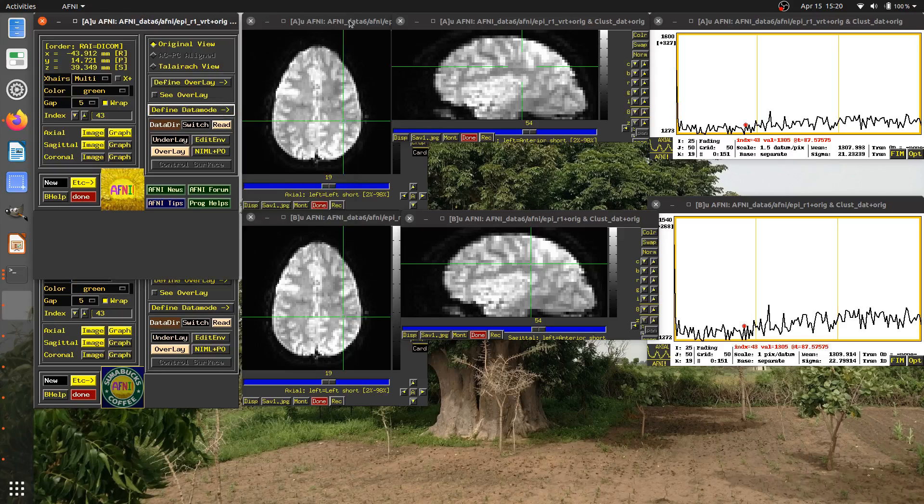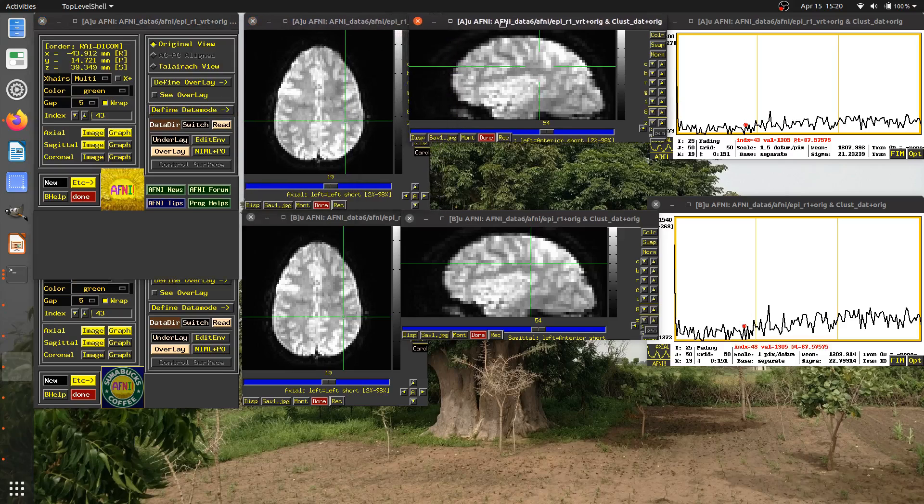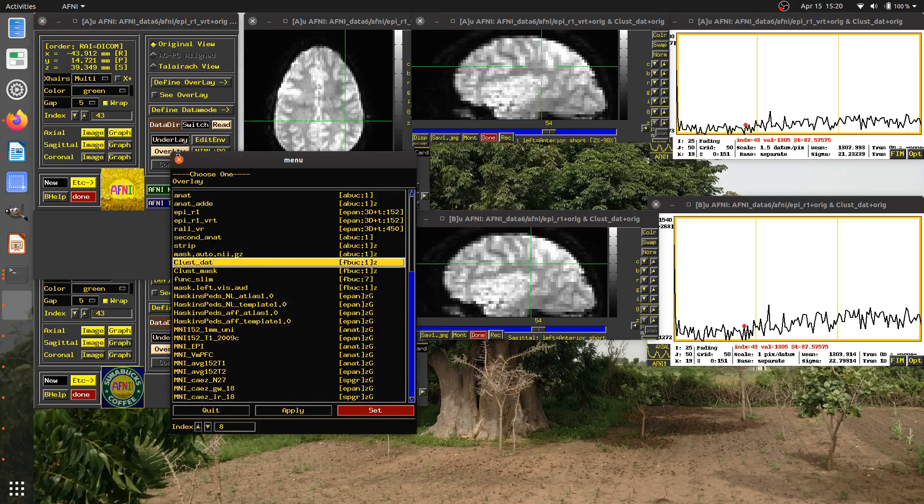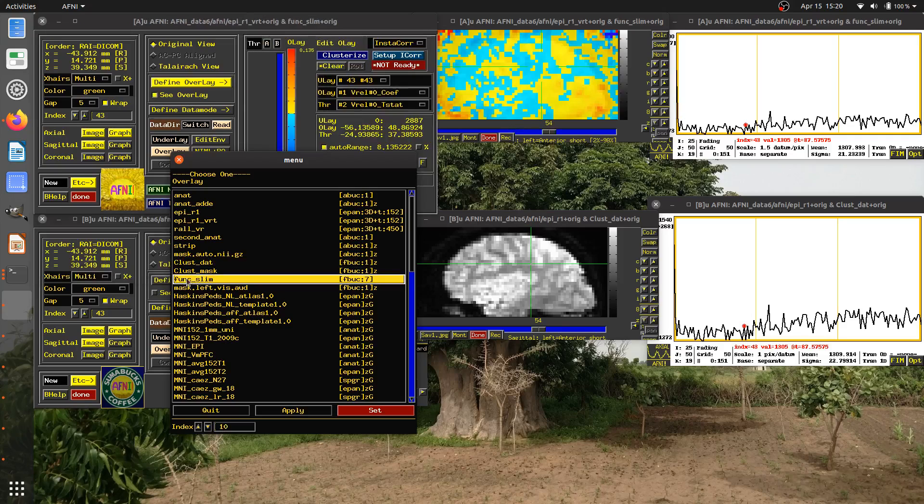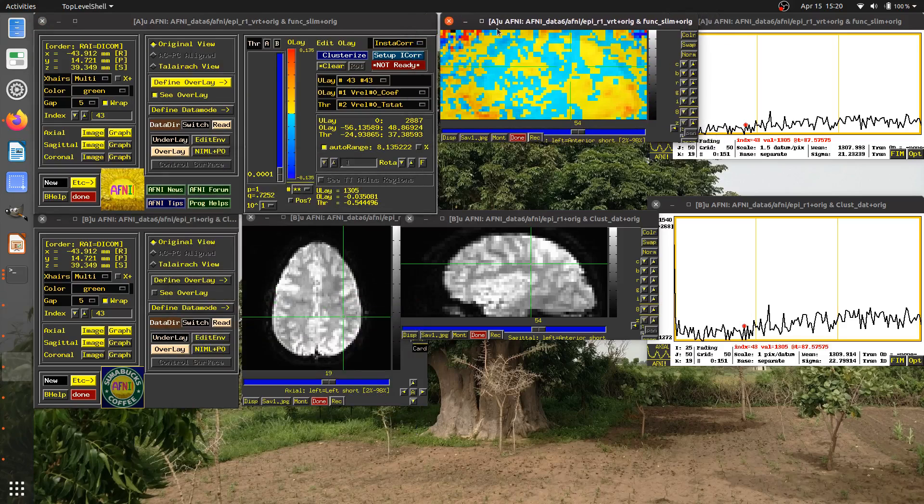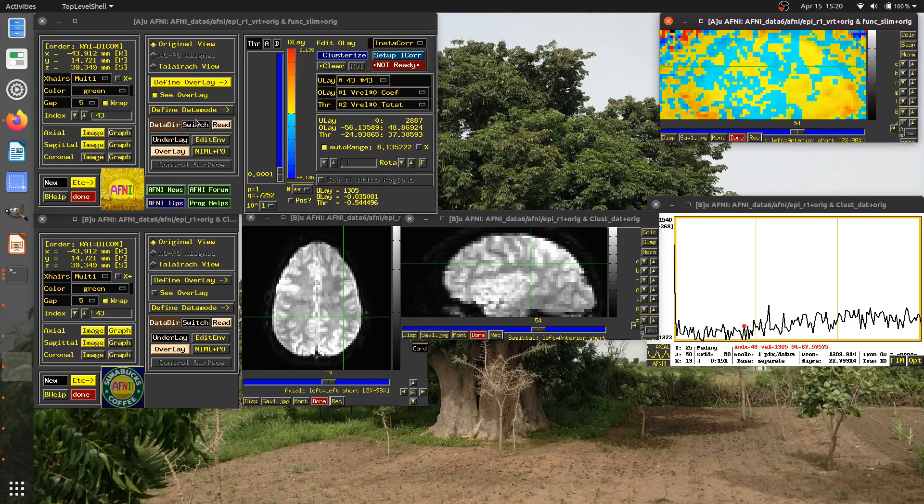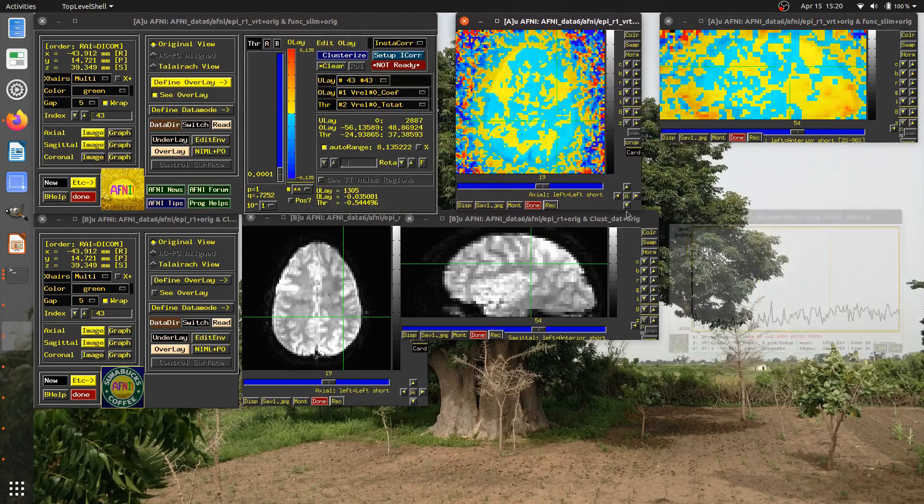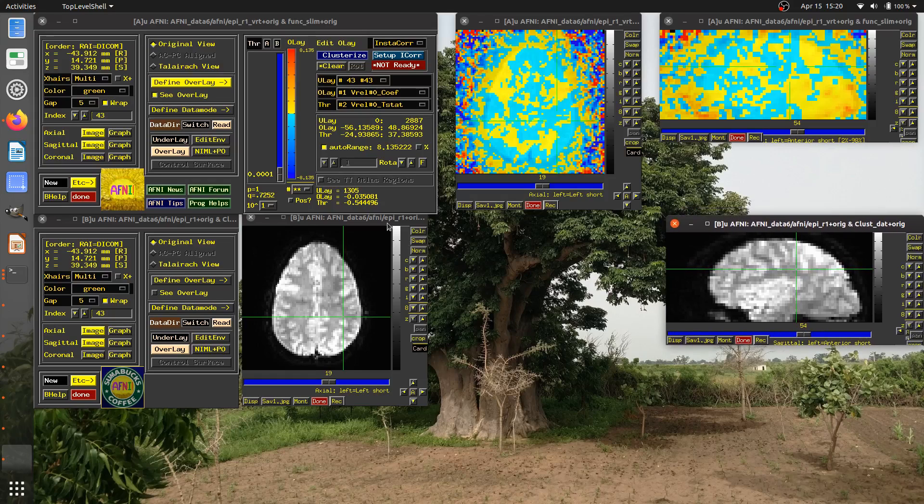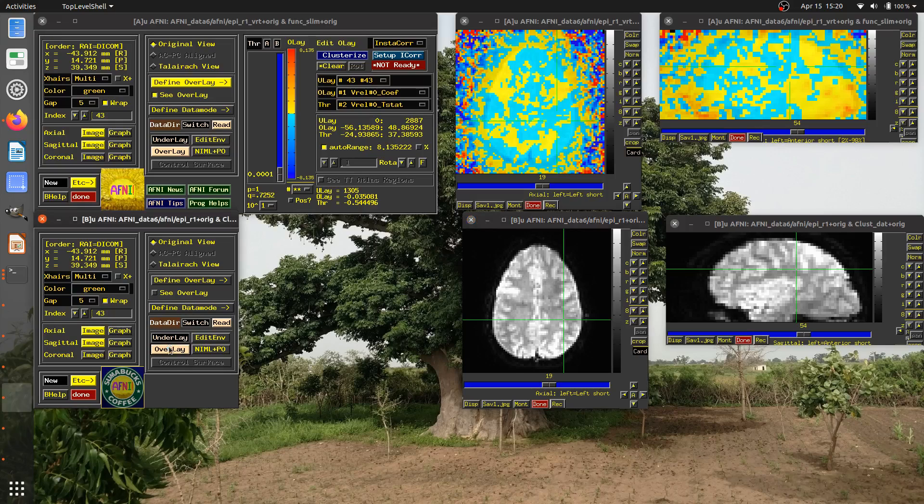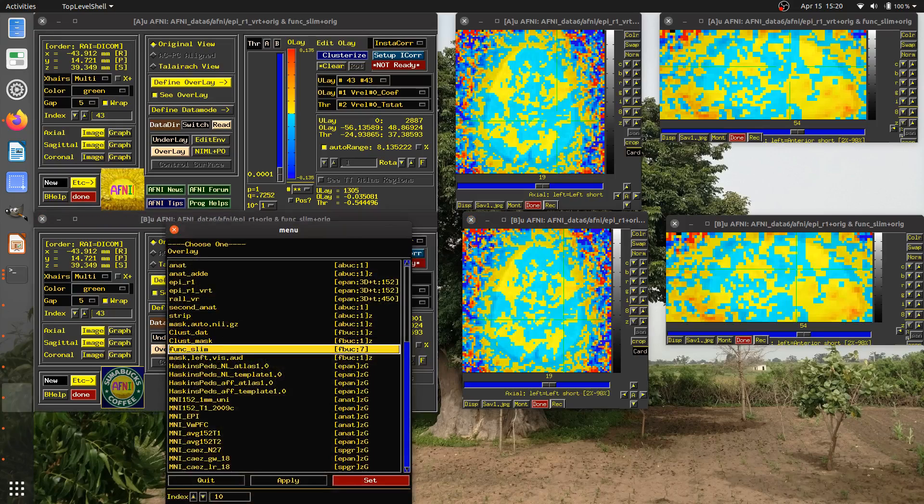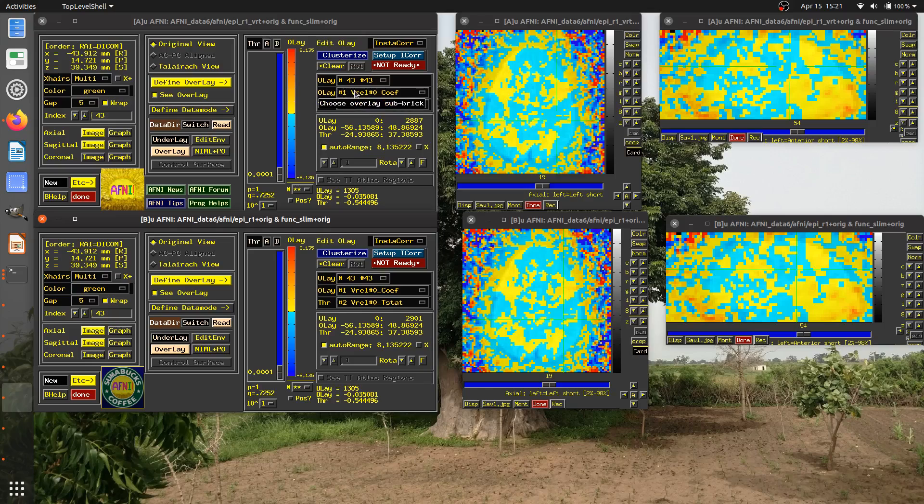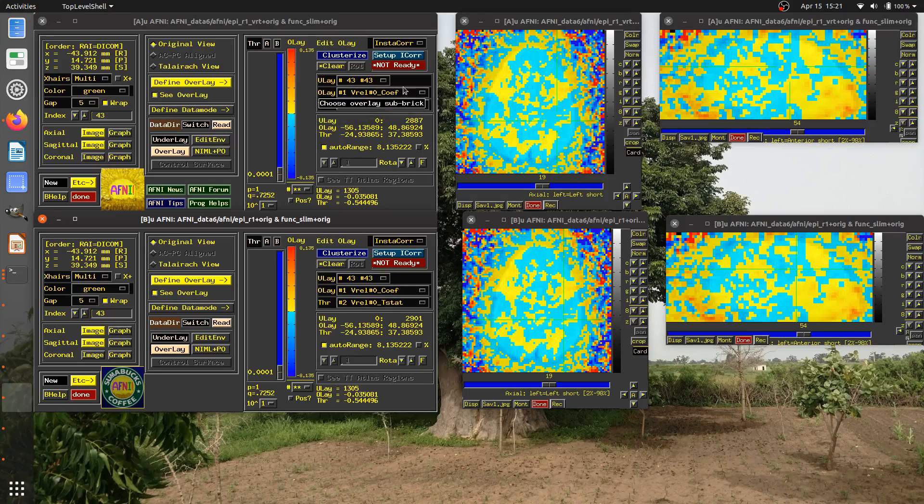Now here we've just been focusing on underlays. Let's take a look if we have an overlay dataset. So I'm going to go here and select overlay in the A controller. And there's a dataset here called func slim, which is a functional statistical dataset or their statistics in it. So I'm going to select that in the A controller. I'm also going to open up in this controller, I'm going to overlay this func slim.